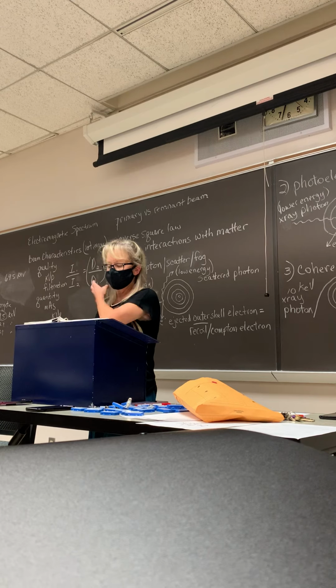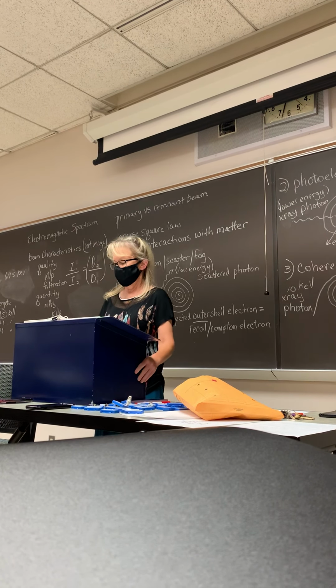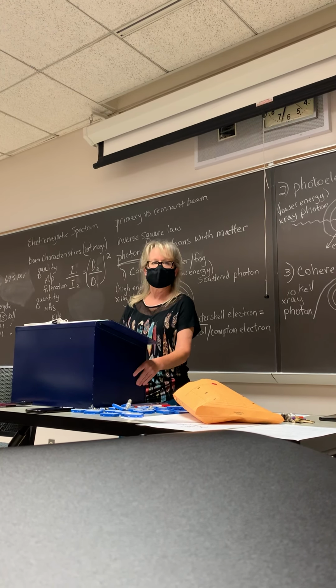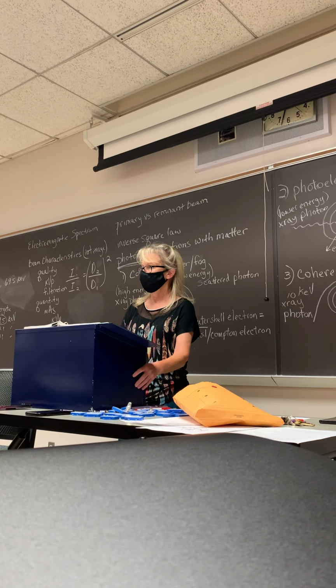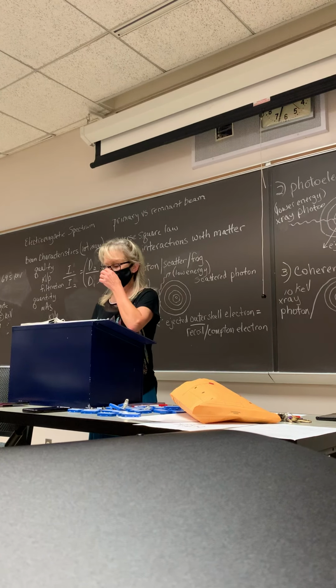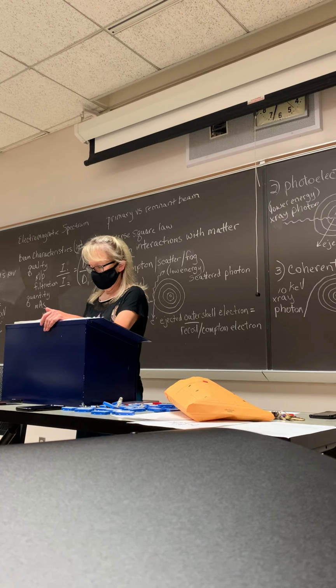Okay, shielding is the next thing. You should always shield your patient. As far as types of shielding, you guys would be able to pick that up, but I just want to make sure you know what a shadow shield is. What is a shadow shield? It never touches the patient, it just makes a shadow, okay? All right, and you should always collimate.